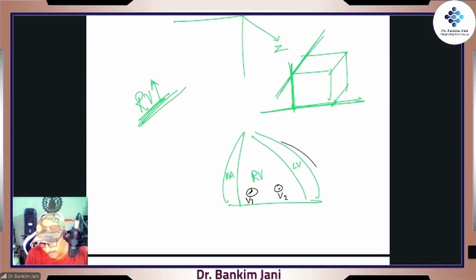When the left ventricle is enlarged, we have V3, then comes V4, then V5, then V6. So even these leads will be affected, because when the left ventricle is enlarged, the leads on the side will be watching it. So that is how they will be enlarged. Simply, the lead which is near to that surface will be representing the enlargement of that particular chamber. Correct?